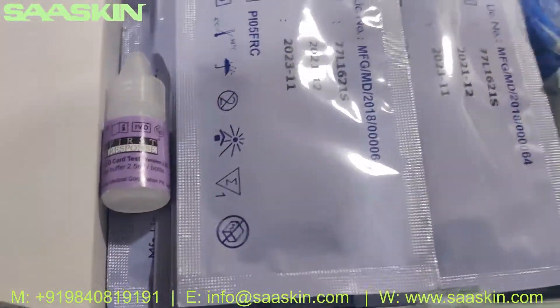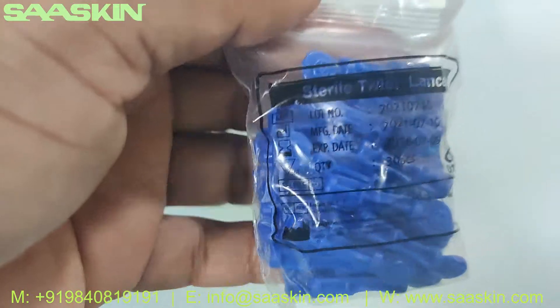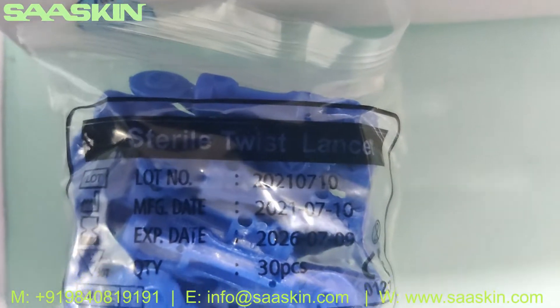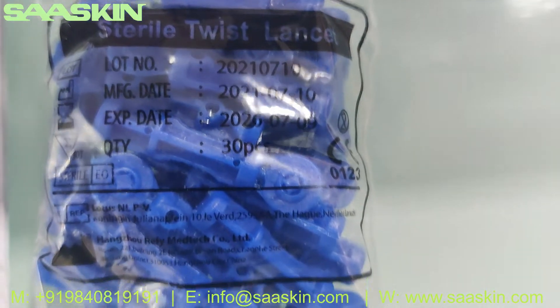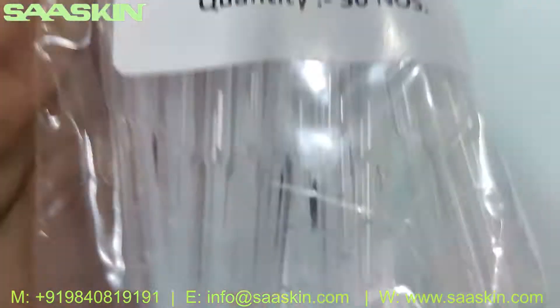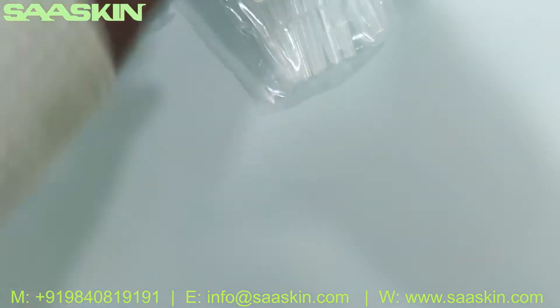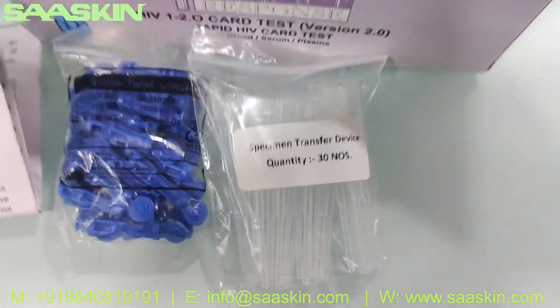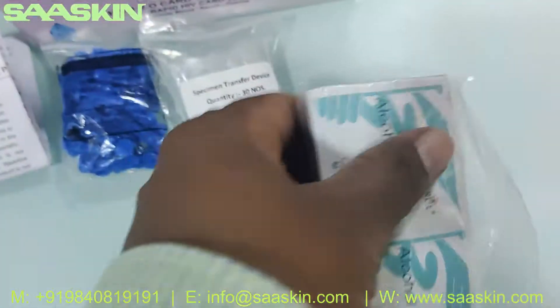Inside the box you get 30 sterile lancets. You also have 30 specimen transfer devices and 30 alcohol swabs.